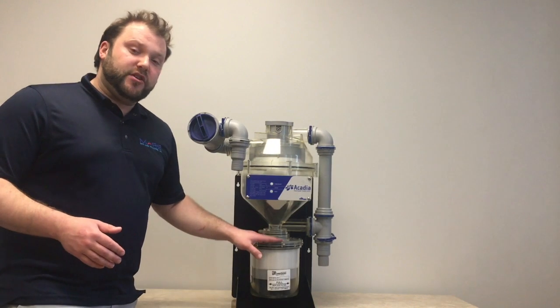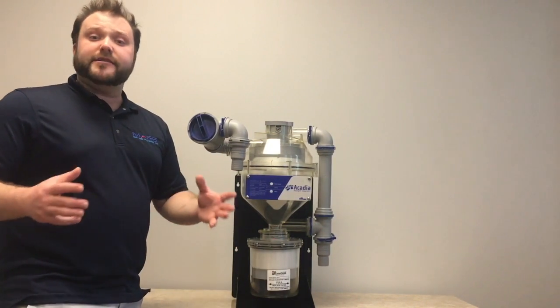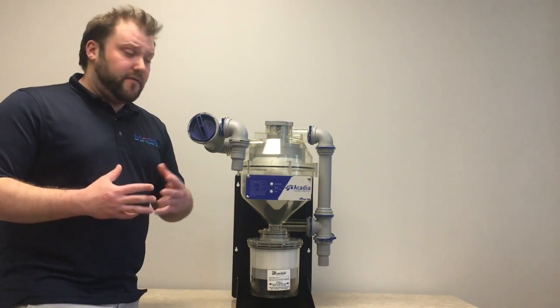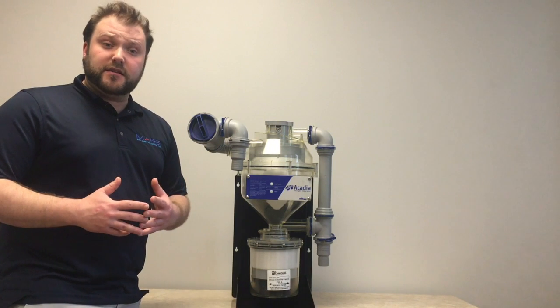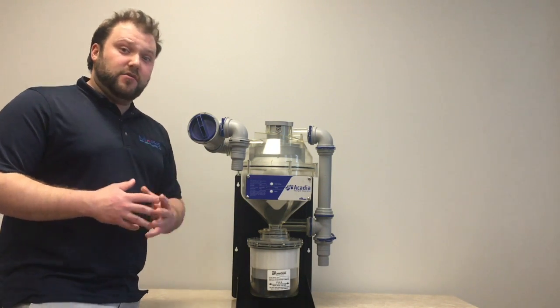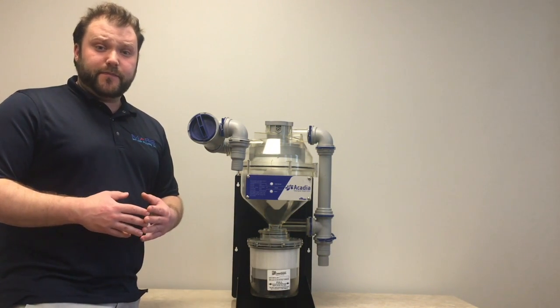How often you have to change your amalgam separator filter will be based on the size of your practice and how much prophy paste you may do. What fills an amalgam separator more than anything is prophy paste from your hygienists. The more hygienists you have, the faster your amalgam separators do tend to fill.